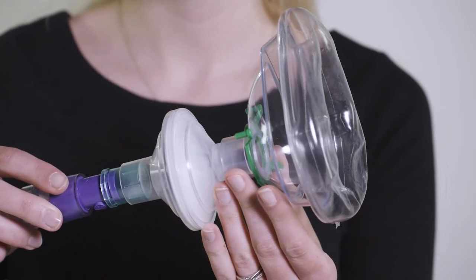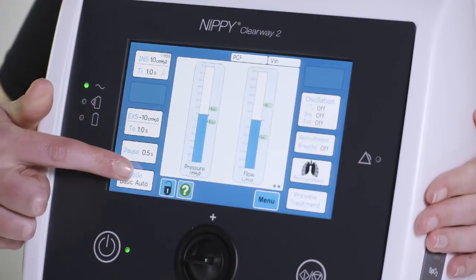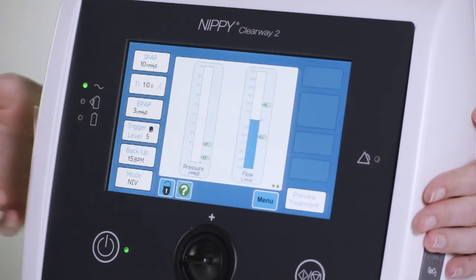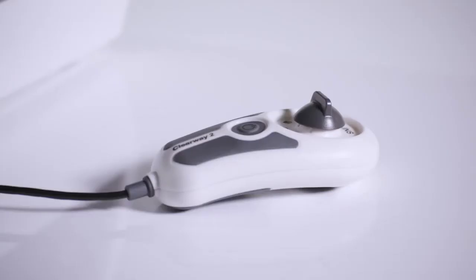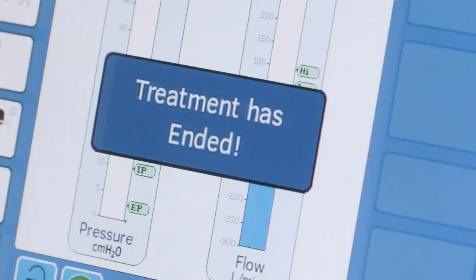Apply the interface to the person using the Clearway 2 as instructed by your clinician. If using an automatic MIE mode, the IPPB or NIV mode, press the start/stop button on either the front of the Clearway 2 or on the handheld control if you have one. The Clearway 2 will then deliver the treatment as prescribed and alert you when the treatment has ended with an audible beep.